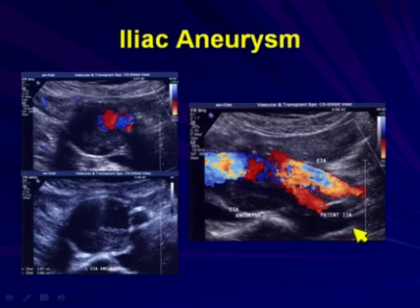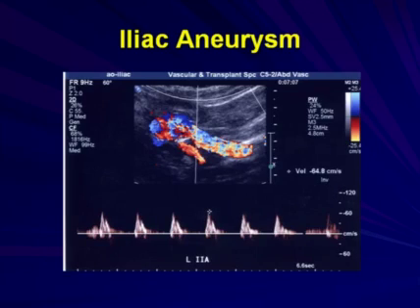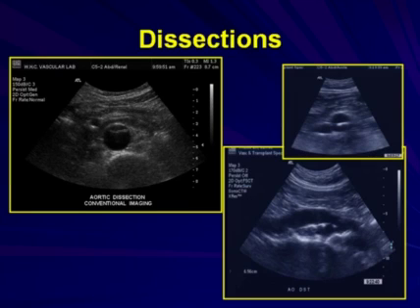And we need to define the size, document the flow through that, so that we know post-hypogastric coiling what will be going on with that. So here's the documentation of the spectral waveform of the hypogastric in preparation for that coiling.